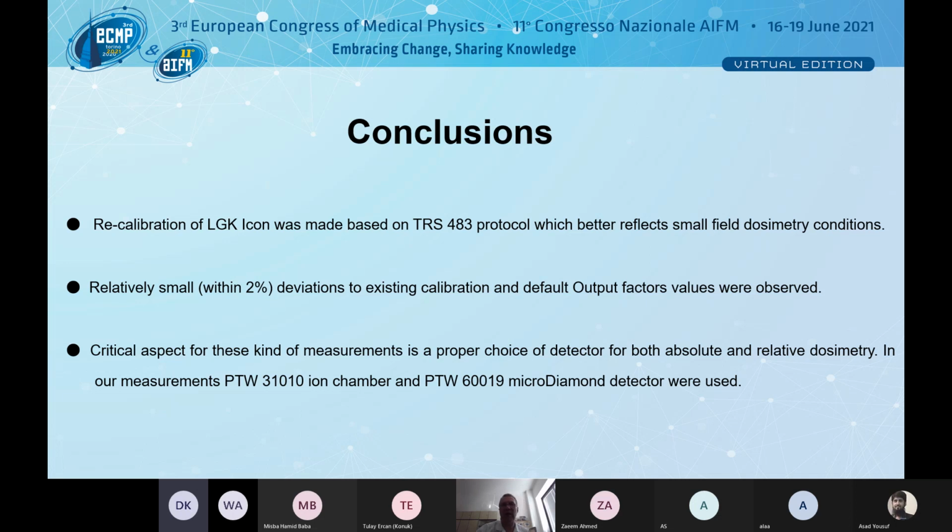So I definitely want to stress that output factors that we do have now in Leksell GammaPlan are very trustworthy. I would not change them. We really are just doing verification for our particular system with those output factors, so I would not touch them. If you're measuring something very different, then I would say your measurement is probably wrong. So be very, very careful if you would be changing output factors at gamma knife.